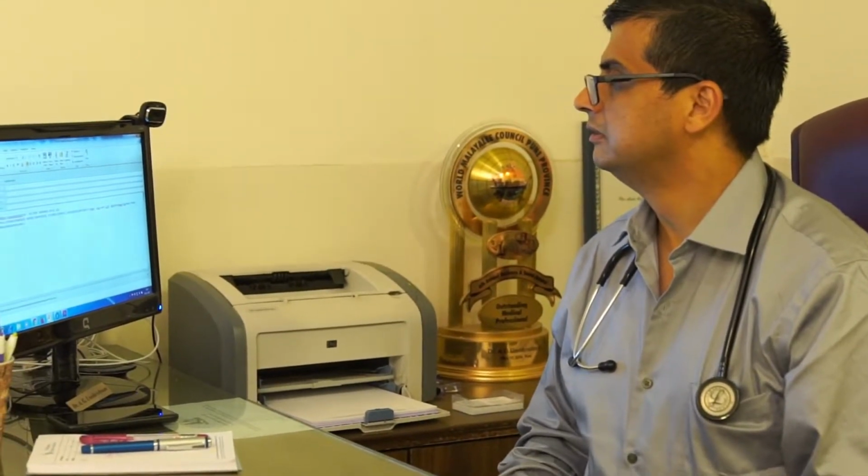We also use it to address glycemic fluctuations or variabilities which occur. We also use it to address the effects of certain therapies. For example, subjects on basal bolus insulin: what's happening to their glucose profiles and how we can do better in controlling their blood glucose levels. Ambulatory glucose profile has helped us in ways more than one.